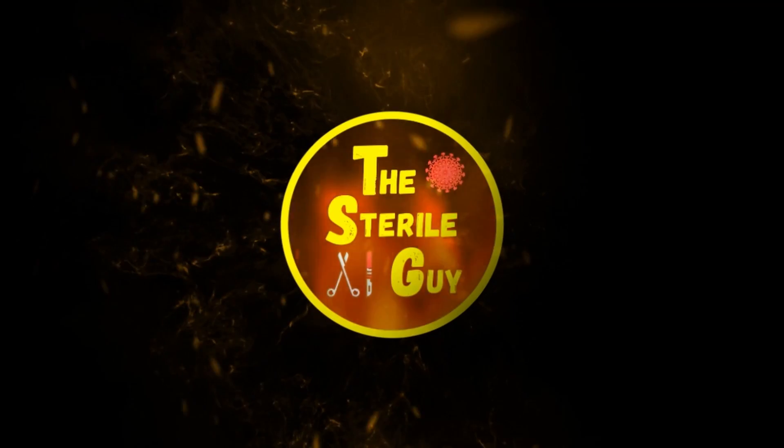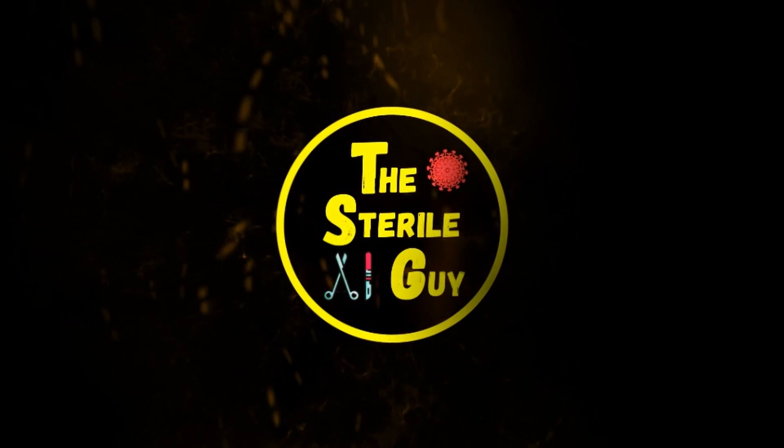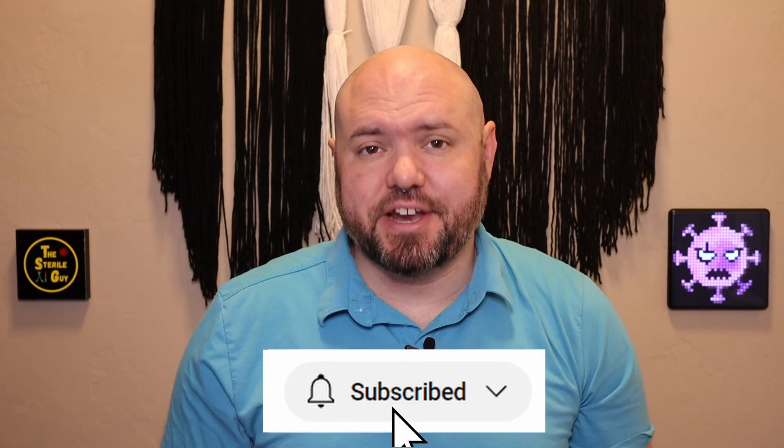This one's very important and this one is missed by the majority of sterile processing departments. Hey sterile processing professionals, Brandon the Sterile Guy here. In today's video, we're going to talk about how to properly load a steam sterilizer.